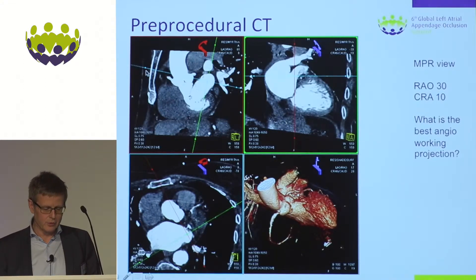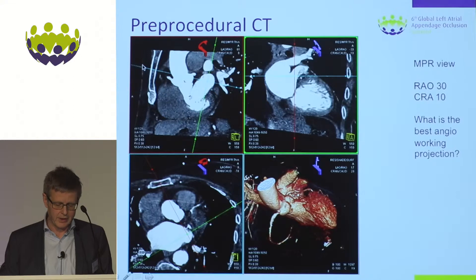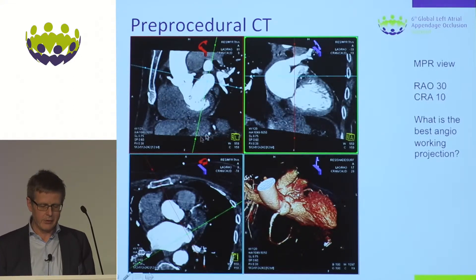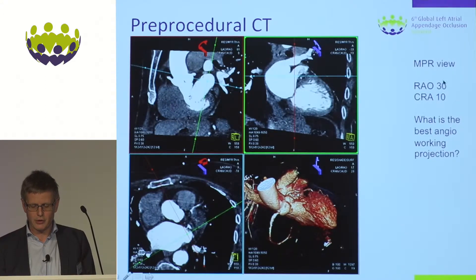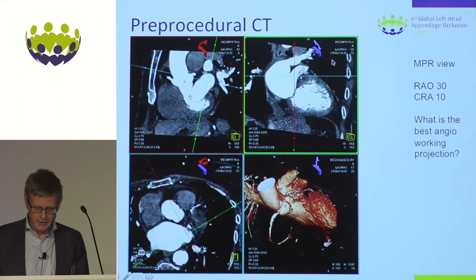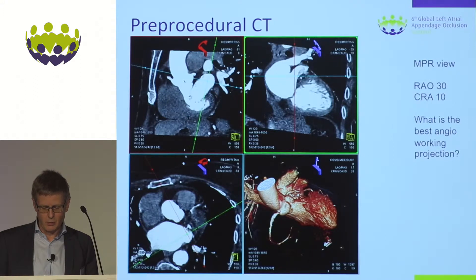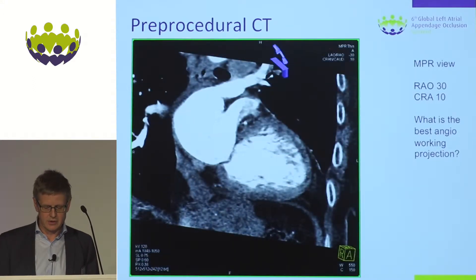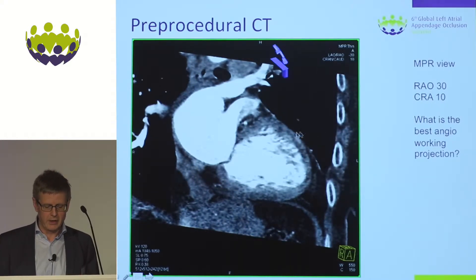In multi-planar reconstruction you can see the AP view, tilt it cranially, or tilt it in RAO. You can obtain what you would see in an RAO 30-degree, 10-degree cranial fluoroscopy projection, and you can definitely choose the most optimal working projection for your procedure. We very often use 30-degree RAO 10 cranial, which gives you all the anatomical markers — the ridge, the upper pulmonary vein, the circumflex, and so forth.